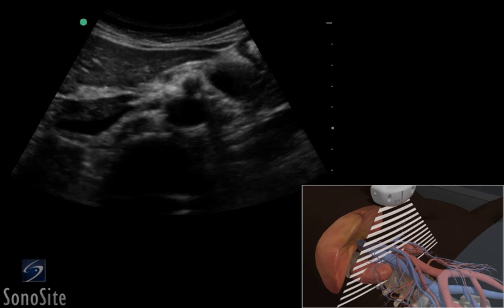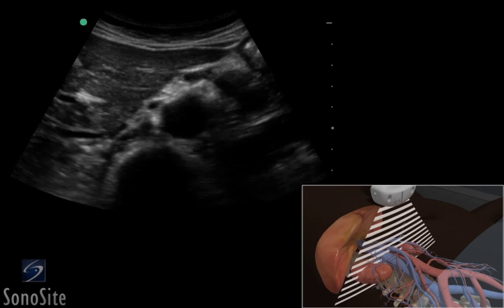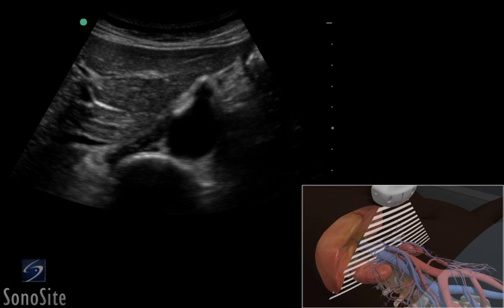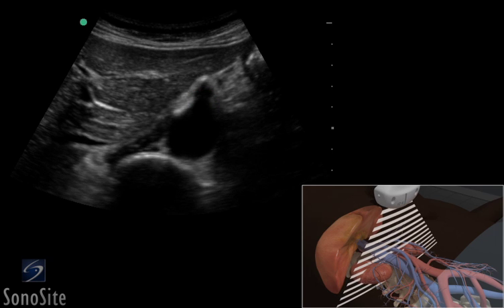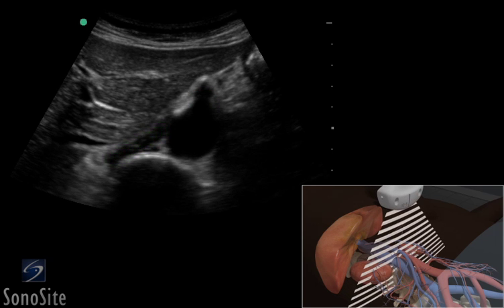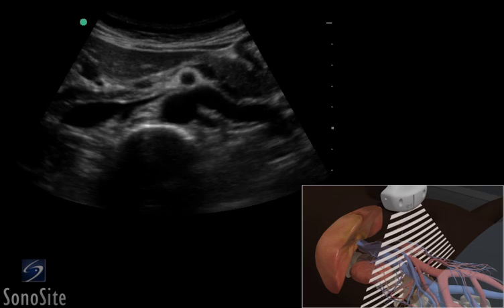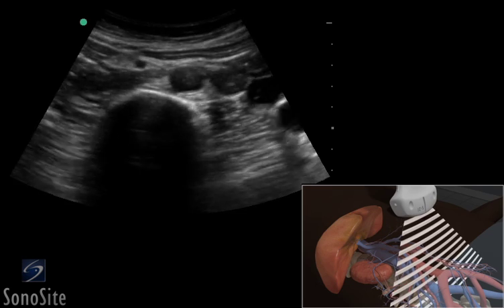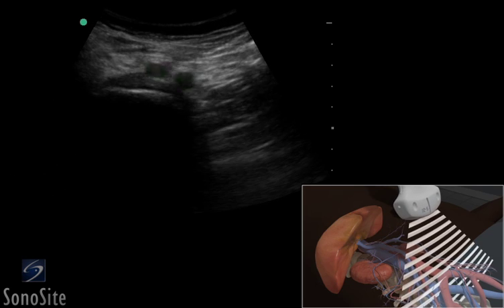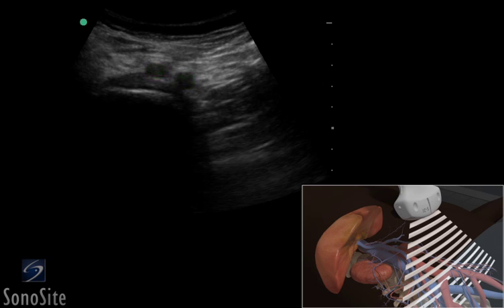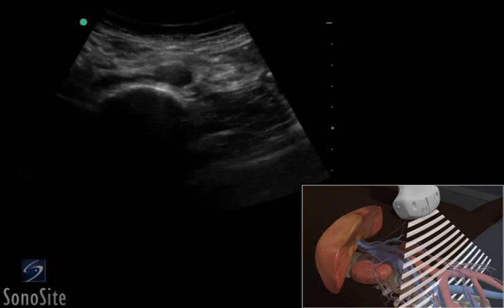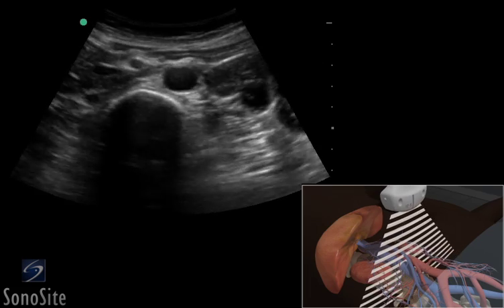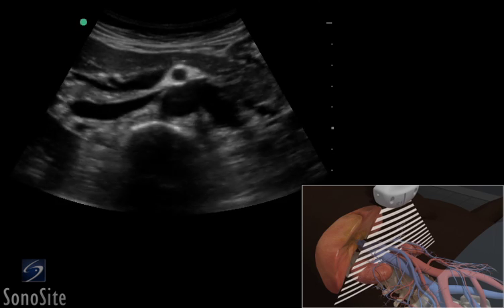The abdominal aorta will course gradually, becoming more superficial as it progresses distally. The transducer is slowly moved distally to identify the celiac trunk, renal arteries, superior mesenteric artery, and bifurcation to the iliac arteries. Note the location of any change in size of the aorta or iliac arteries, and measure in long and short axis views from outer wall to outer wall to determine the true diameter.